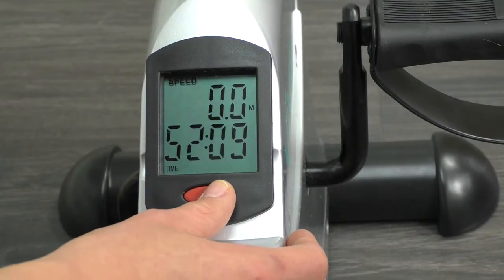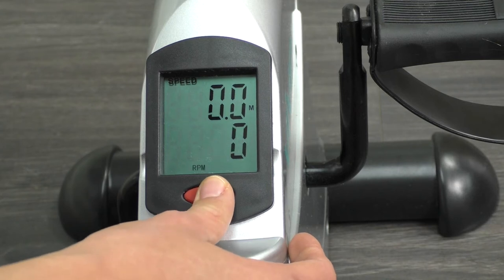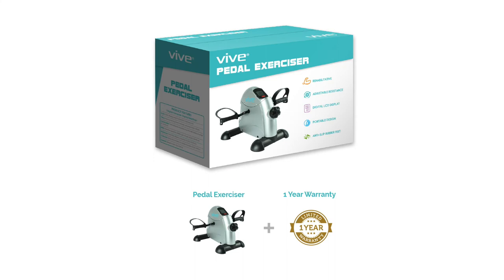Your workout results display on a large LCD screen, letting you know the distance covered, your RPM, speed, time, and number of calories burned, and it's protected by a one-year warranty.